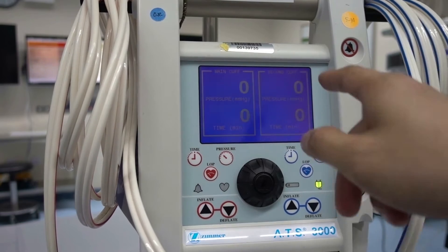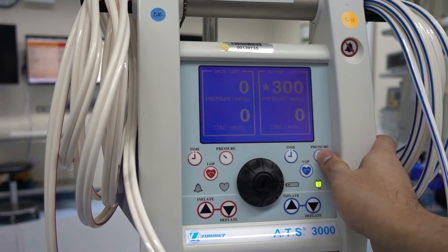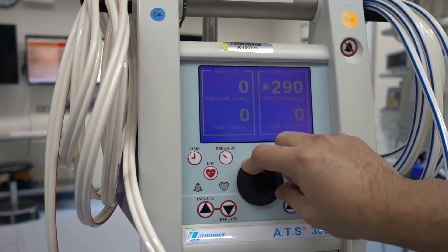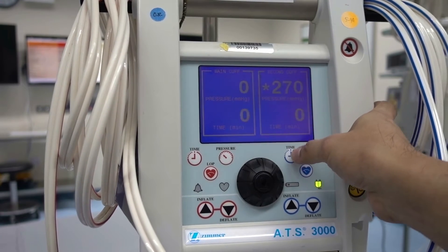To set the desired pressure and activate the shuttle knob, first press the pressure button, then turn the shuttle knob. Repeat the same procedure to modify the required time needed.